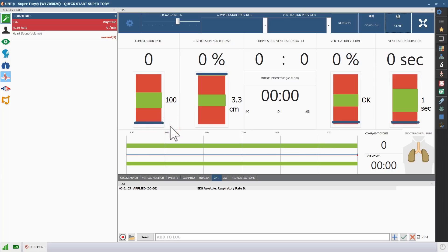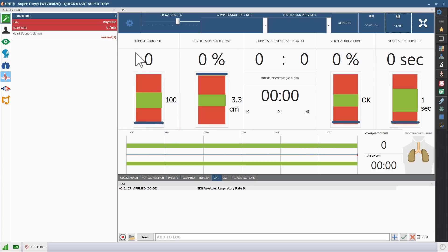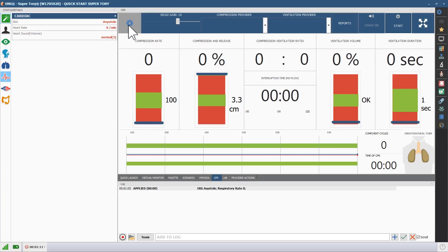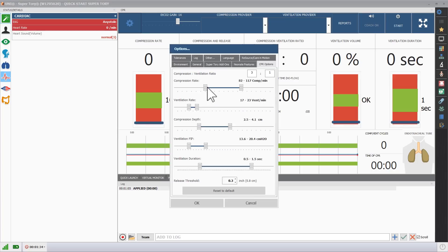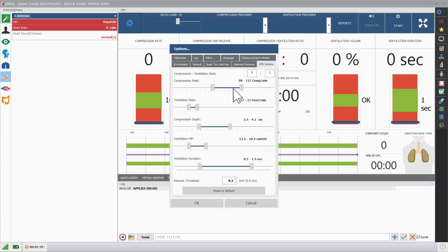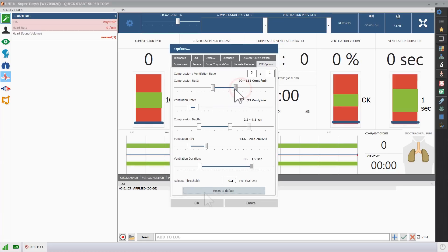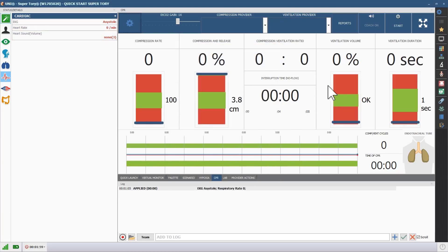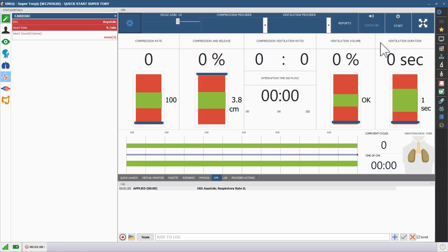To adjust the target parameters for CPR, click the menu icon in the upper left of the CPR window. You can broaden the effective parameters for beginners or narrow them for more precise requirements. Click the Start button to start recording a session.